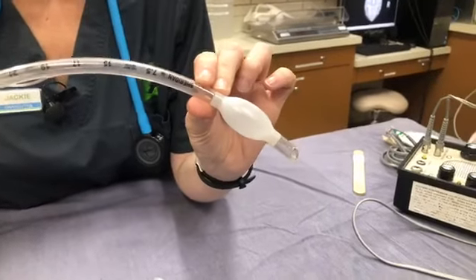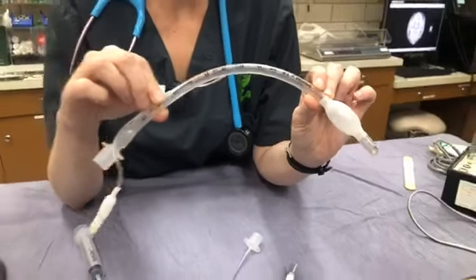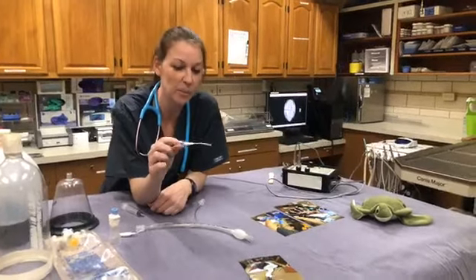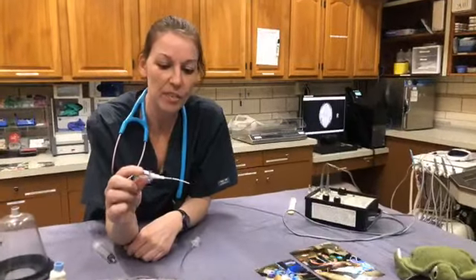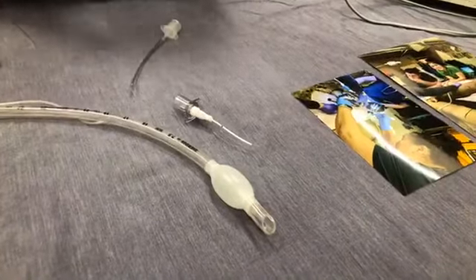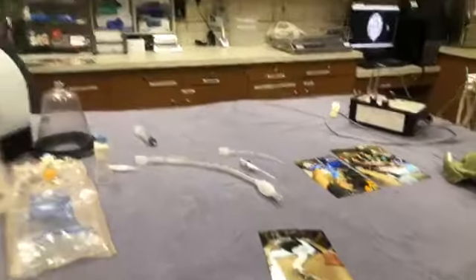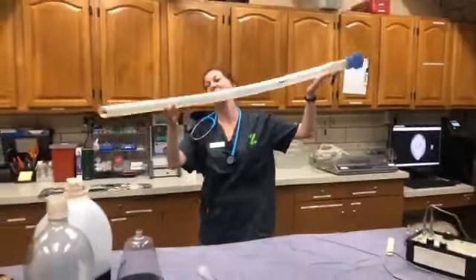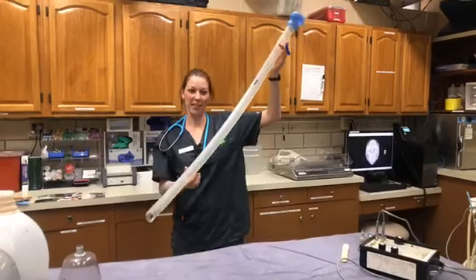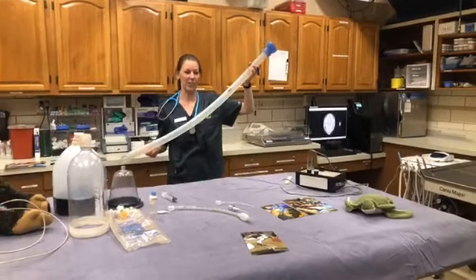Which is about the average size you would use on a human, or maybe a goat, or a larger primate. And so this is what we would use for like a tiny little bird, like maybe a small dove or a finch. So such a drastic size. We have to be so flexible in what we do here. And then I just wanted to show you the drastic difference. This guy is what we would use for maybe an elephant or a bull giraffe, so much bigger. So you can see how specialized we are here. There's nothing that is really one size fits all.